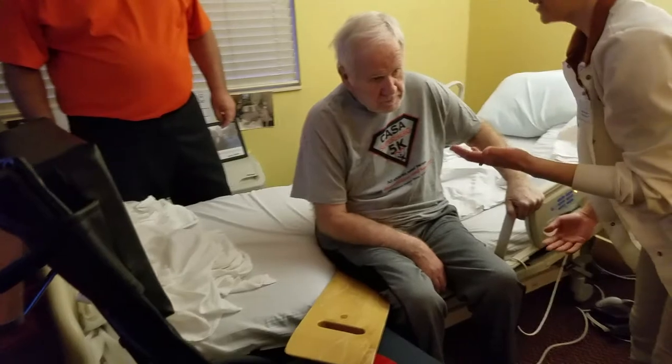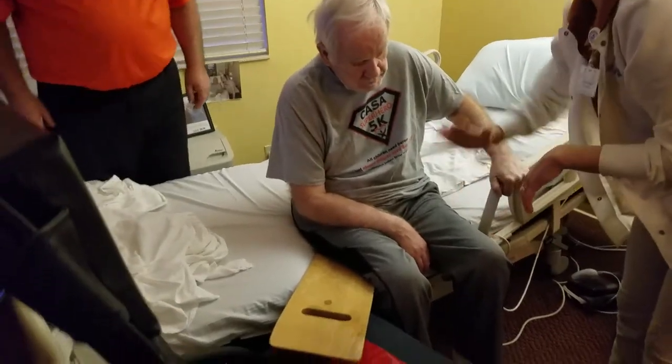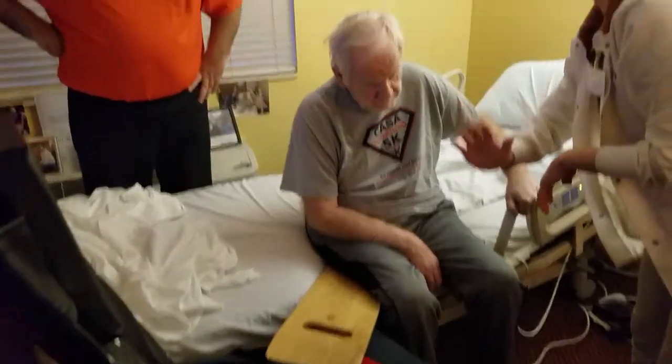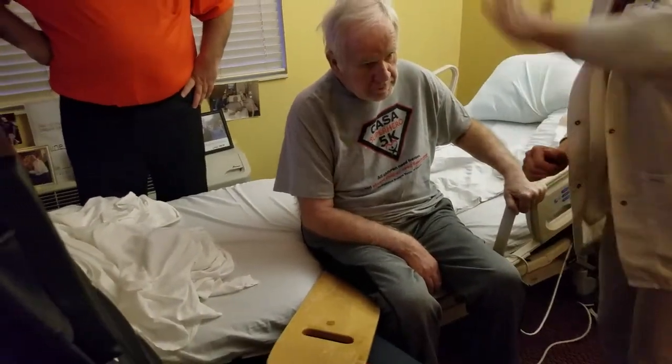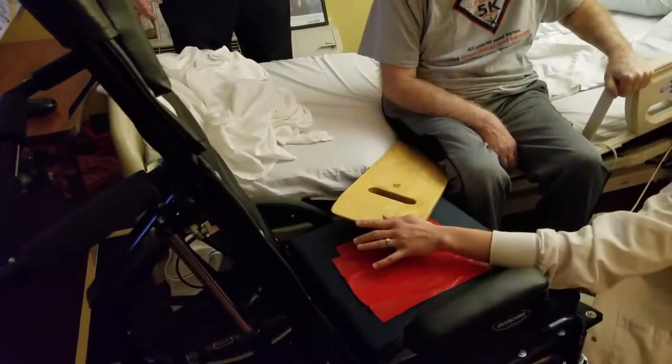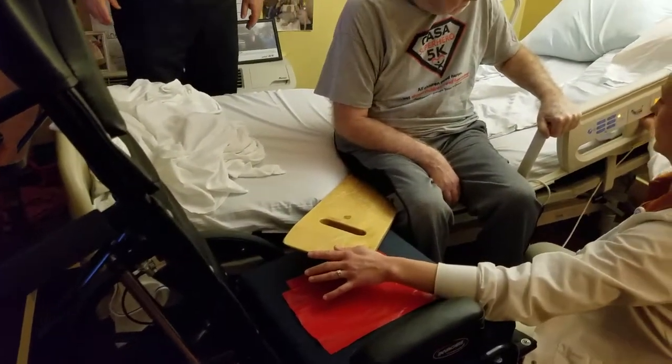The board should be at an angle like this. You need to look at the height of the bed too — you don't want to be going uphill because that's going to make lifting him harder. It'd be better for him to slide down than to go up a hill.